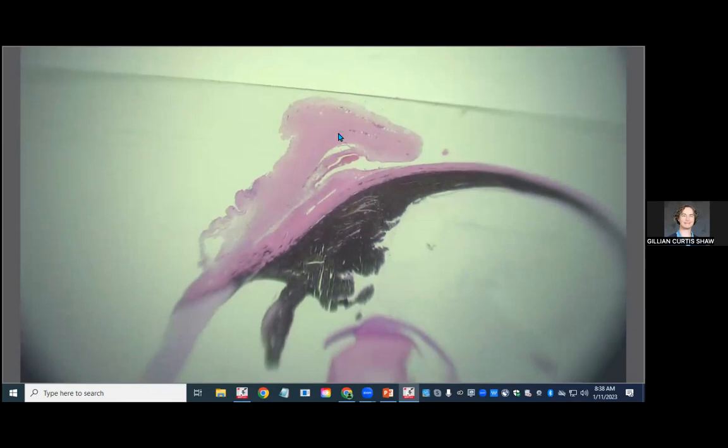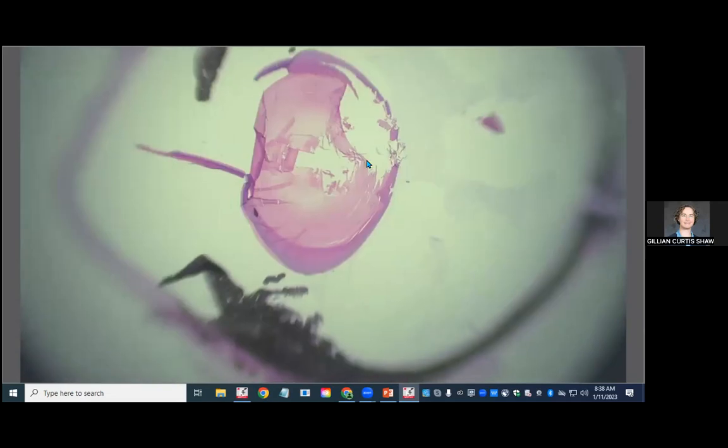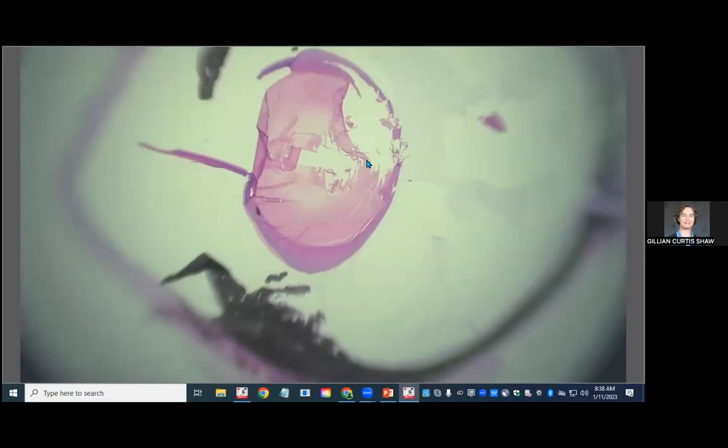And remember that speckling that I showed in the episcleral tissue, we'll take a higher mag look at that as well. The lens is otherwise kind of boring, and I can't remember how affected.